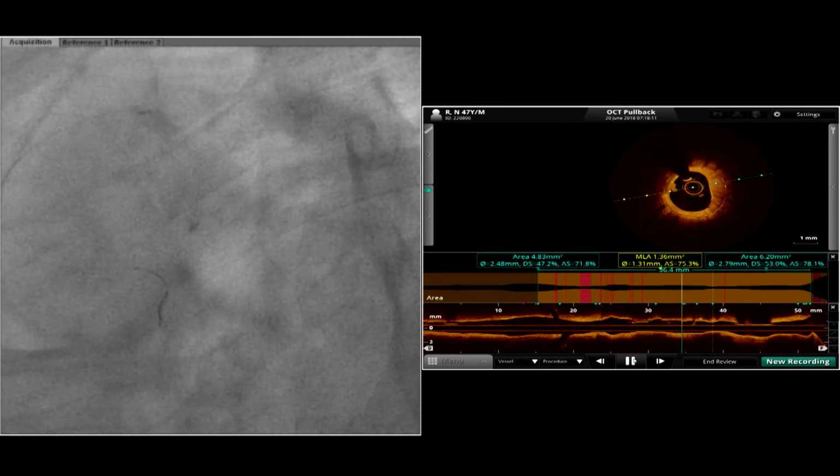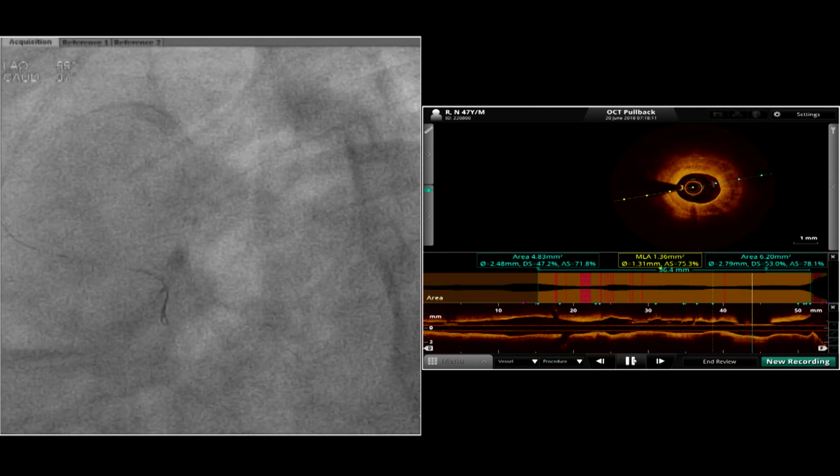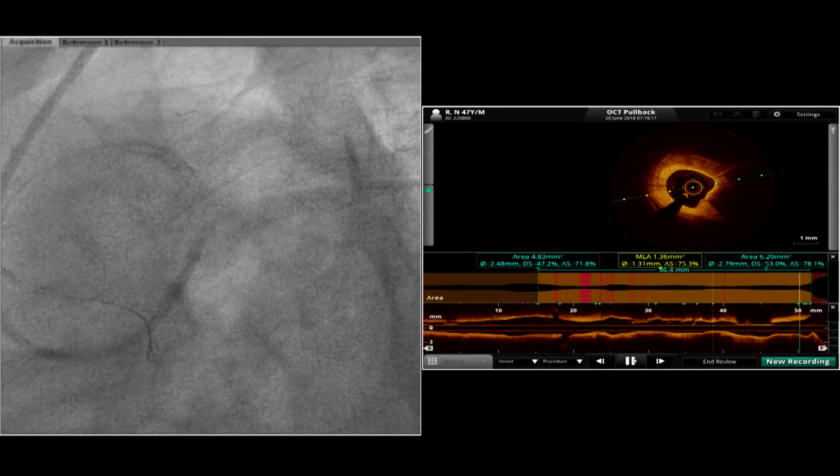So we'll take a post dilatation 3.5. The distal vessel diameter reference was only 2.5. The proximal was about 3.5 plus. So we'll use a modified optimization technique, 3.5 15 NC. And then we'll go for a post run. If it were a pure stent coverage issue with a thrombus, we could have thought of aspiration, but seeing a new atherosclerosis totally changes the plan.